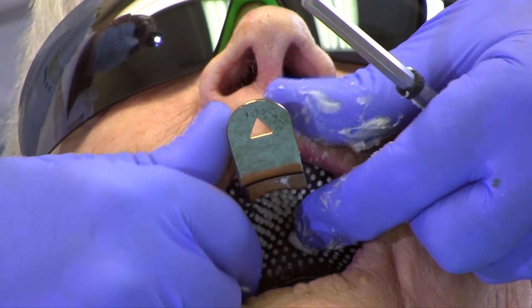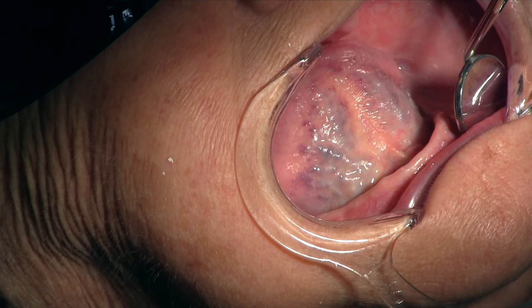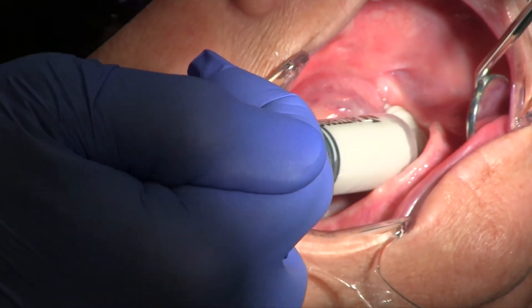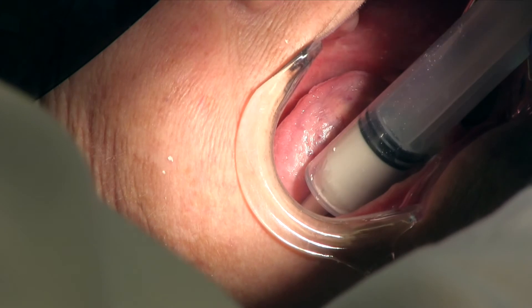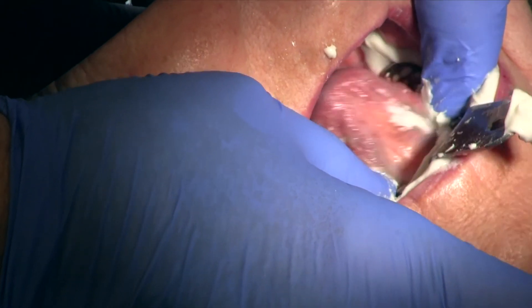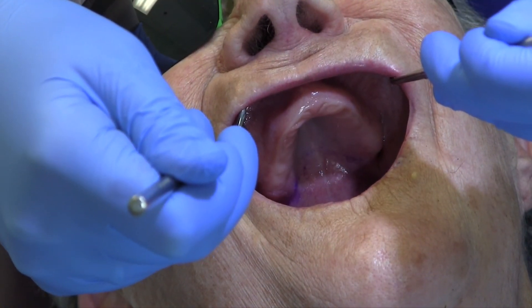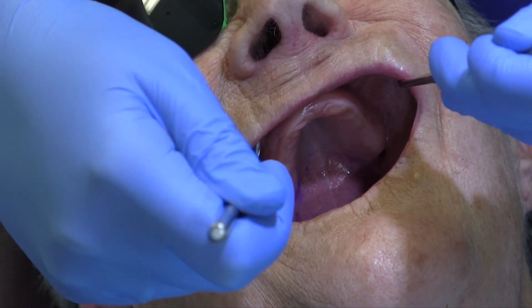Border mold as described in the video on final impressions. In the mandible, slip or roll the tip of the syringe just below the tongue. Syringe until you see material between the tongue and the ridge, then move forward to the lingual frenum. In the buccal vestibule, begin adjacent to the retromolar pad and move forward to the labial frenum. Then repeat on the opposite side. Seat the impression and border mold. If you don't plan to use a syringe, try using two mirrors to improve the registration of the vestibular roll.